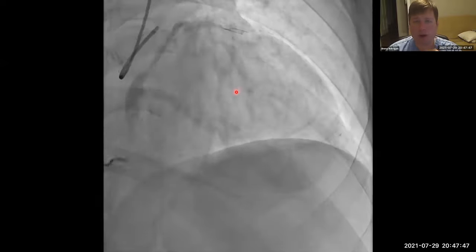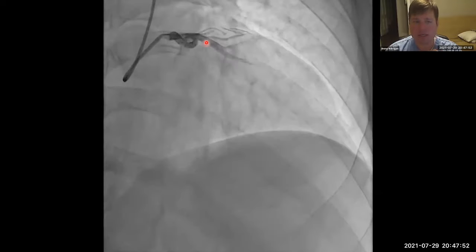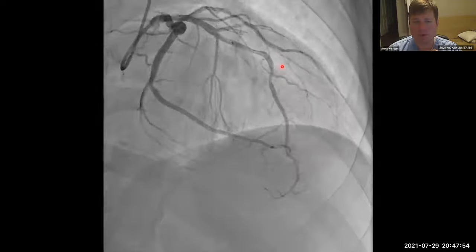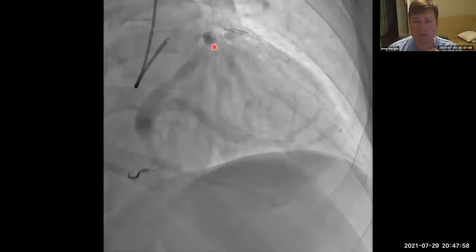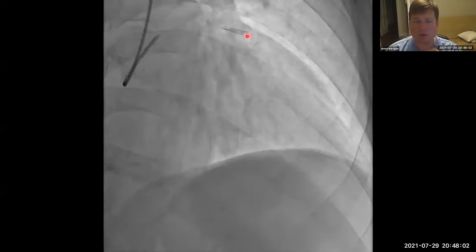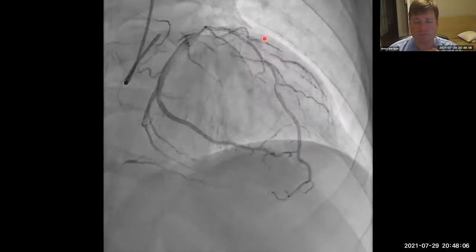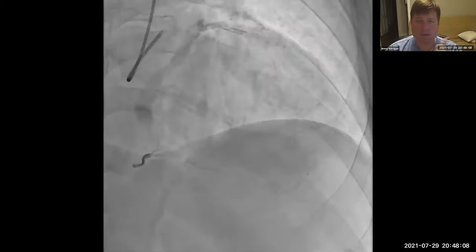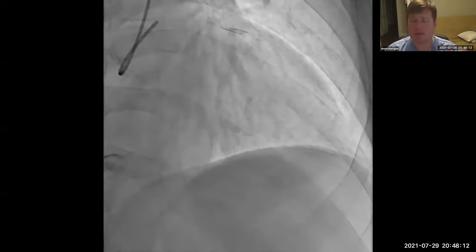When reviewing the angiograms, I was more interested in a couple of spots in the left circulation. So in the LAD proper, some corners and bends there. And then in this diagonal, probably the second diagonal, there is a lesion at the corner that's about 90% stenosed. So the patient has an RCA CTO. I think that the diagonal is culprit, but what if the LAD is ischemic as well?